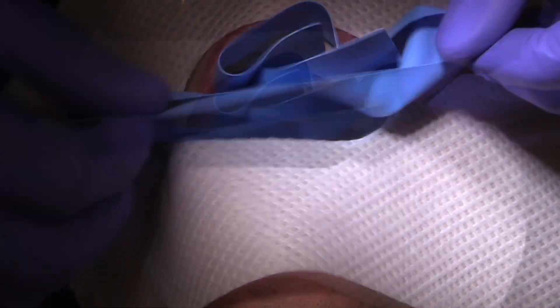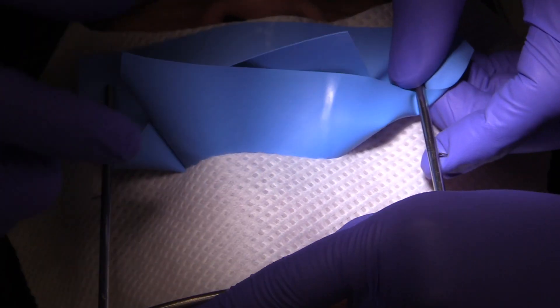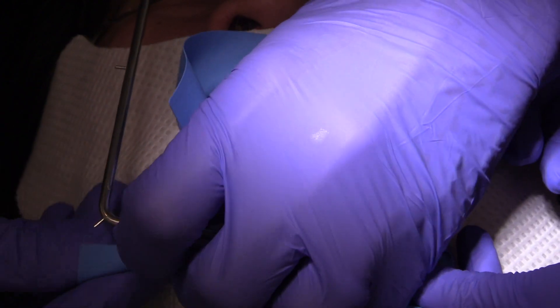I always like to use a napkin because the napkins are going to keep the patient from getting any chafing from the rubber dam. Sometimes there's some leakage and you'd like to have some way of absorbing some of that leakage.